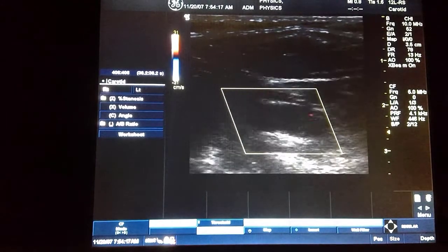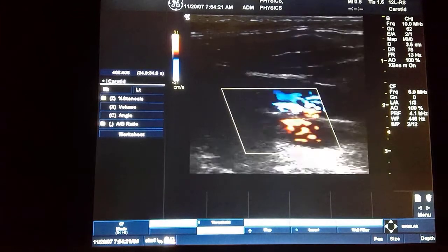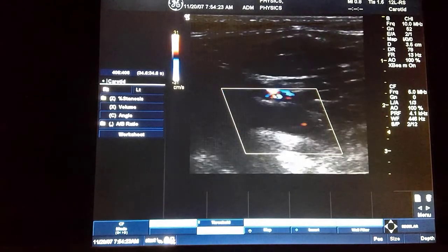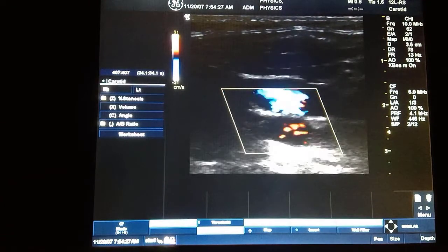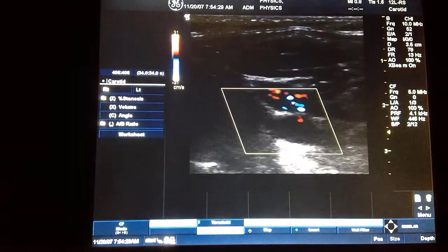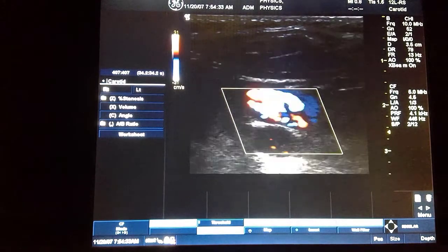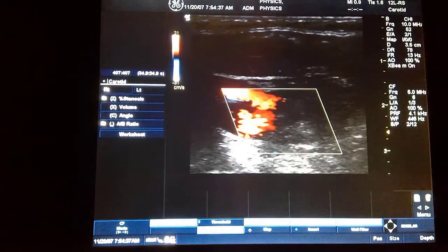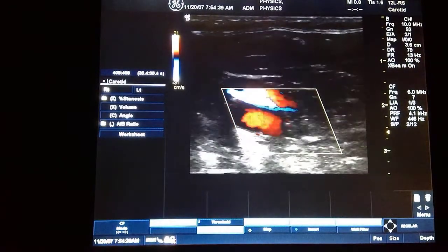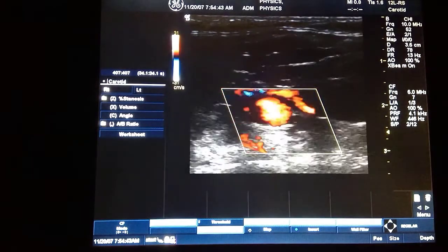Again, as a sonographer, you need to pay attention to your tools. You want to make sure that you're using the right tools, that they're set appropriately, so you're providing the correct information for the radiologist or the cardiologist to review. I'm going to bring that color gain back up again. We typically want, again, wall-to-wall fill, or we want to be able to recognize any jets that we're seeing off of valves as that blood moves.